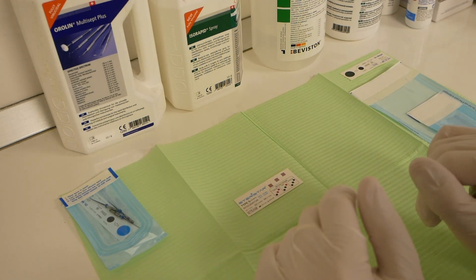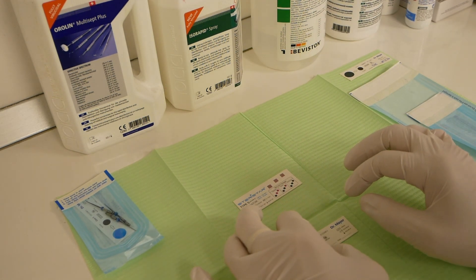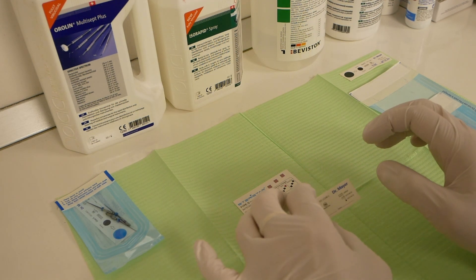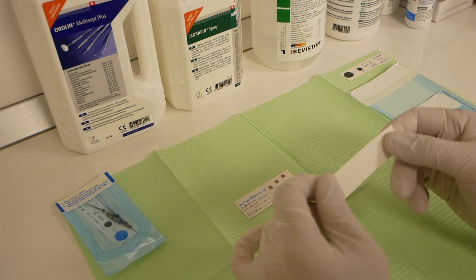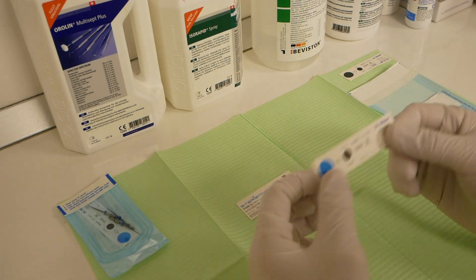To ensure sterilization inside the pouch has occurred, we need a Class 5 integrator strip. This comes in the form of separate paper strips such as these ones.